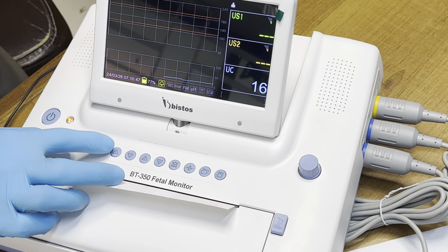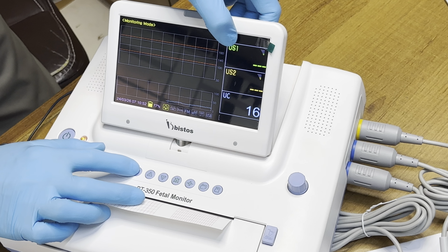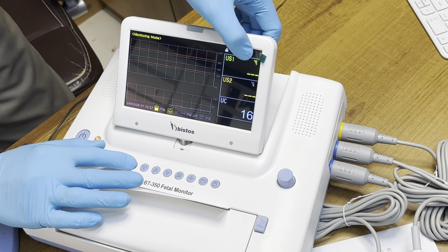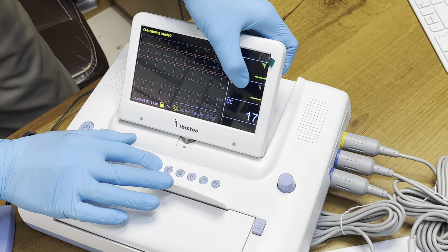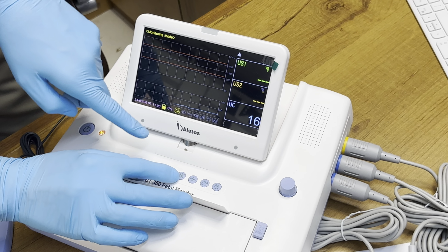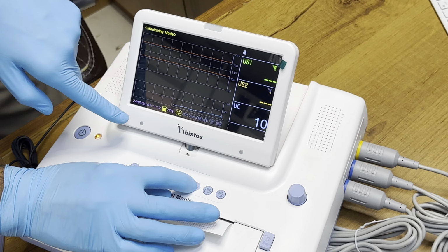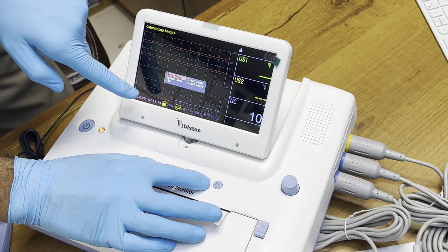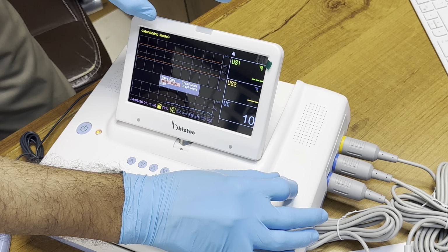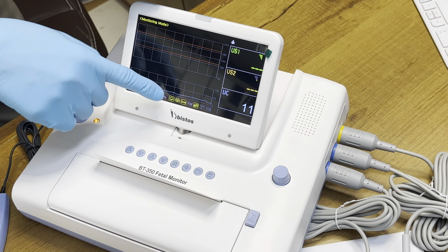Now these are the functions. This is for the volume, up and down. This is volume 1 for ultrasound 1. You can see the green indication going up and down. This is the first volume. This is the second volume. Then this is the alarm mute. It will mute the alarm if there is any alarm. You can see the alarm here. Now this is for the marking, and this is to save the trends or data inside the system. We are just escaping it again, and this is for the printing. When you press it, it will give the printing.